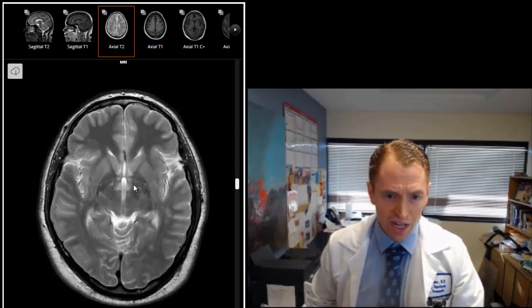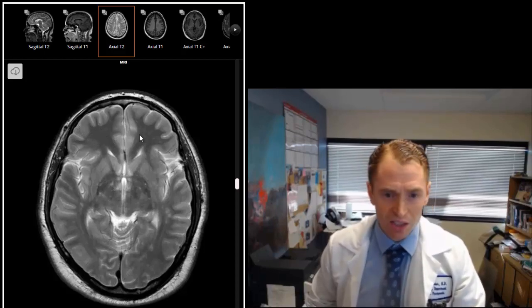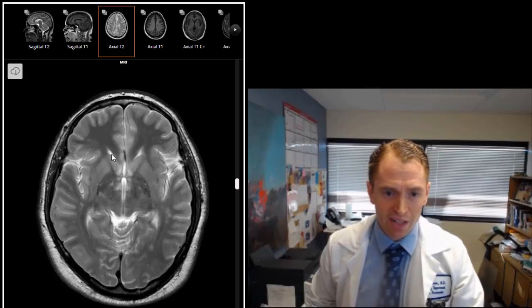On the T2 scan the white matter appears dark and the cortex or the surface of the brain with the cells appears bright. You can see the deep gray nuclei, the caudate and the putamen here for instance.